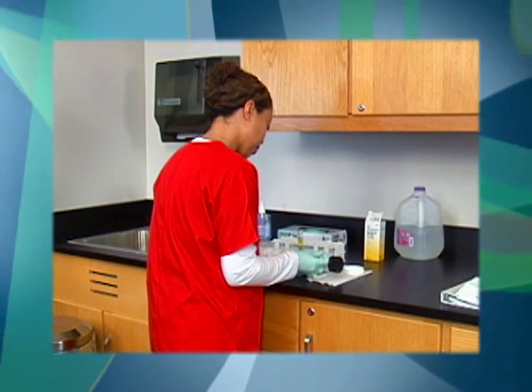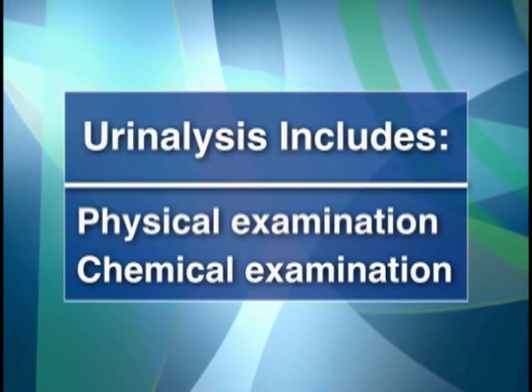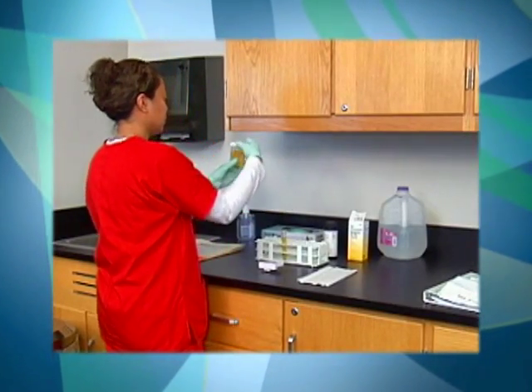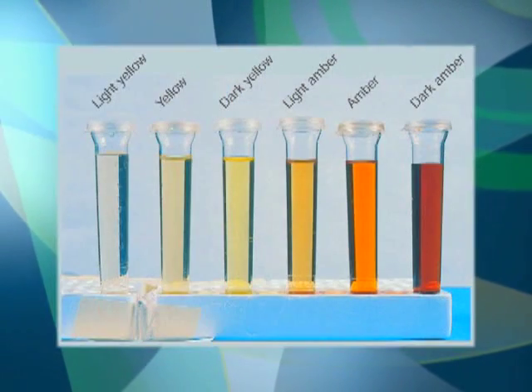Urinalysis is the laboratory test most commonly performed in the medical office. Urinalysis includes a physical and chemical examination of a urine specimen. The physical examination of urine includes an assessment of the color and appearance of the urine specimen.